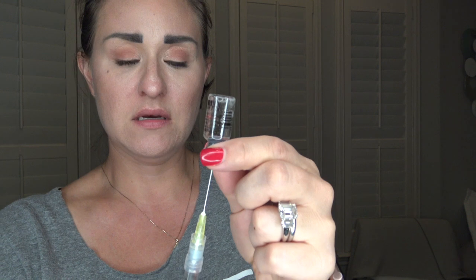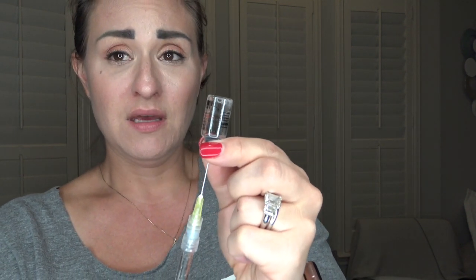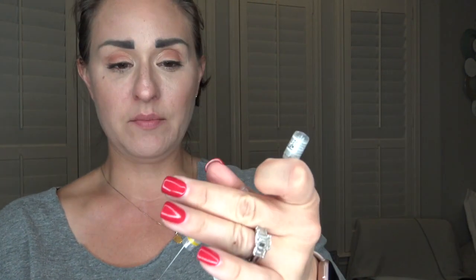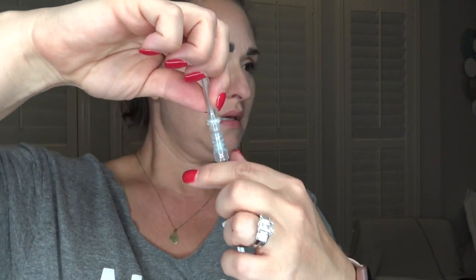It's important to remember to use the large needle for injecting the water in, but also for getting the medication back out. Do not take your injection needle and put it in here. You want to use your injection needle only one time — when it's piercing your skin. If you pierce the bottle with that needle, it's going to dull the needle and it's going to hurt more when you do your injection. Always make sure the needle you use for your injection is only used when you're giving your injection.